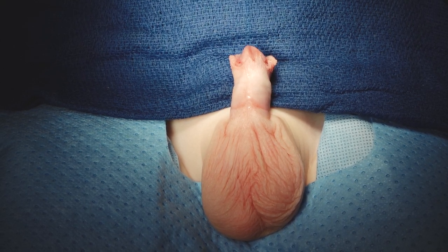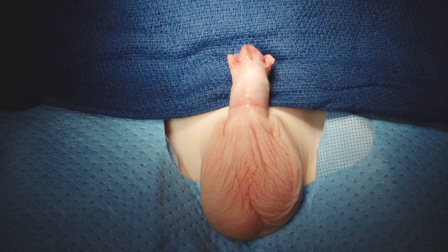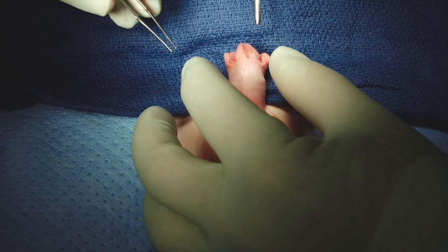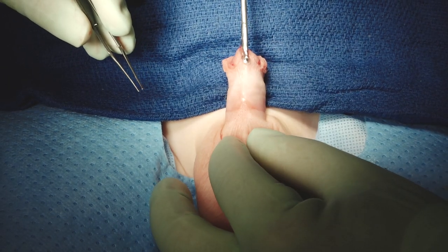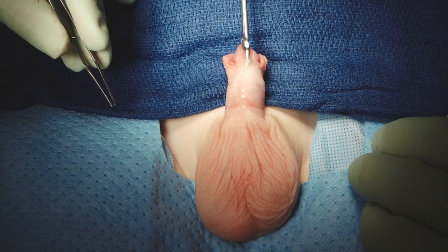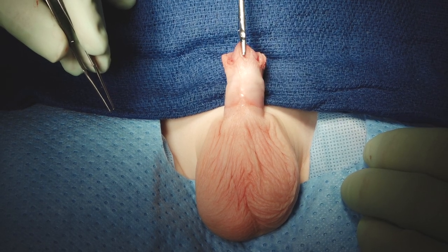Dr. Bush and Dr. Snodgrass here at the Hypospadias Specialty Center. We haven't shown you a distal hypospadias repair in a while, so we thought today would be a good day for that. Here's a boy with distal hypospadias. We always start out by putting in a sound — the vernacular is to say he doesn't have a thin urethra, but what we're really saying is does this guy have good dartos over the urethra?